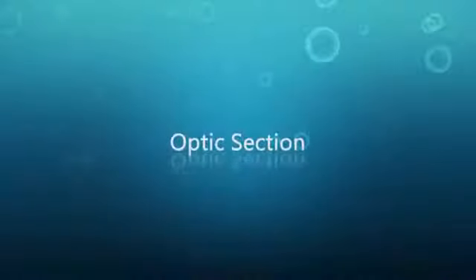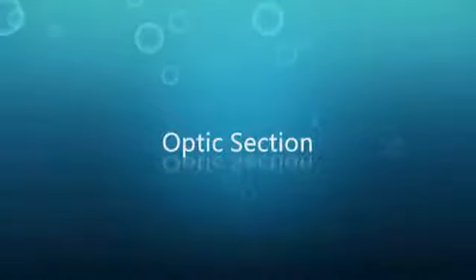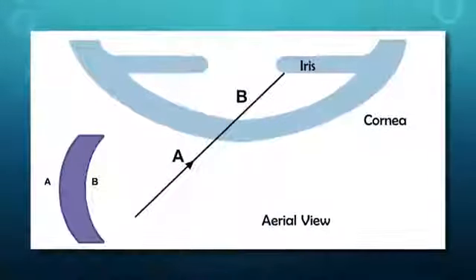Magnification generally begins from low to medium. Optic section. A parallelepiped can be transformed to an optic section by narrowing the slit width to a thin slit.